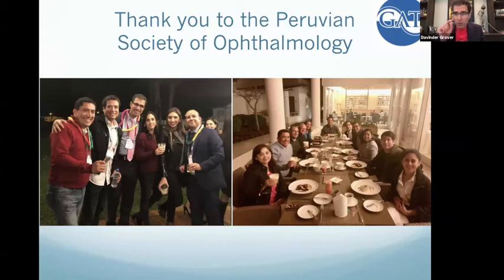So when you do that, say you're doing a GATT after a trabeculectomy, on gonioscopy you have to look at where your sclerostomy is. Because if your sclerostomy is involving the canal, then when you go around with the suture, it may stop there. You have to go the opposite way. If it's anterior to the canal and the canal is untouched, then it's not a problem. So look preoperatively where your sclerotomy site is, and then you may need to avoid that. That may be a good case for the hemi-GATT, where you just go around it and treat half of it.